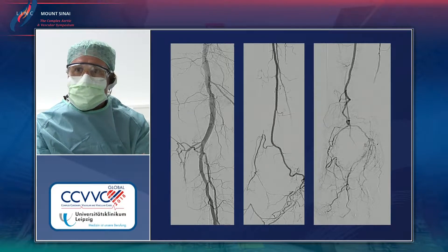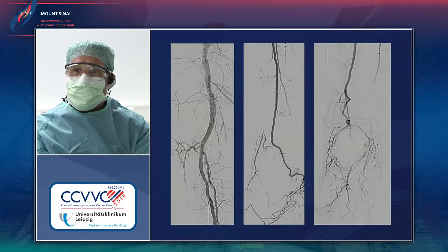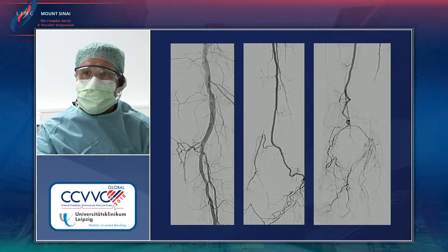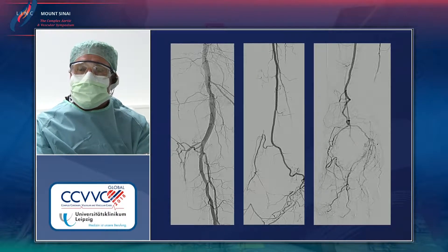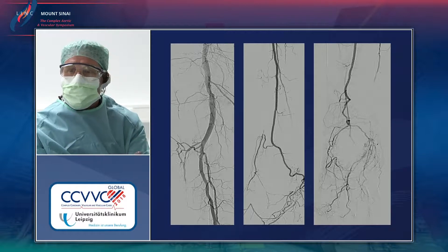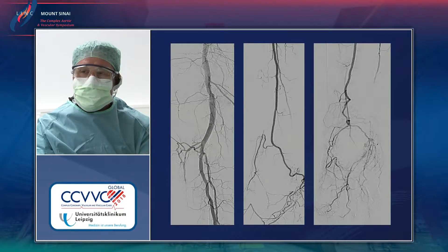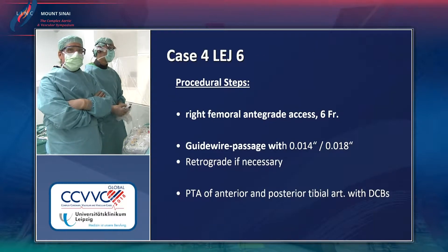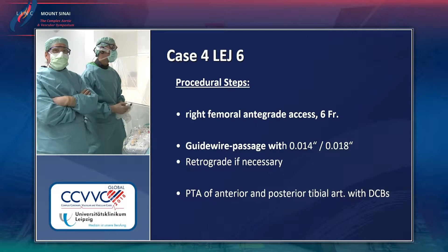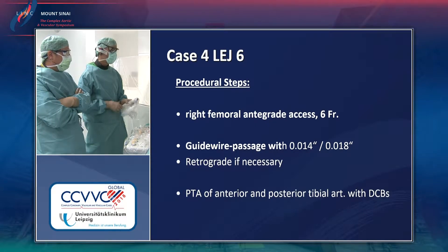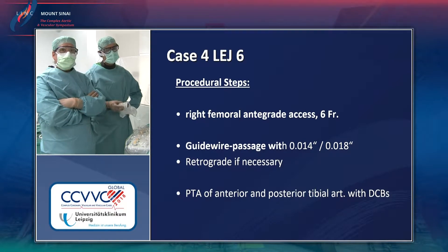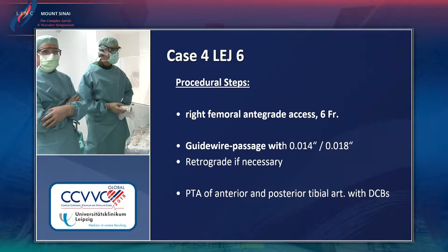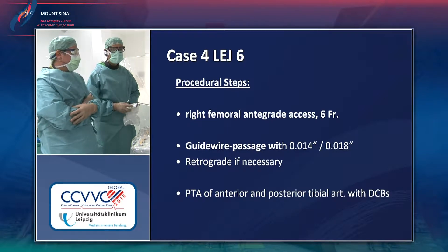This is the angiography of the below-the-knee arteries. Popliteal is okay, but there is a long occlusion of the anterior tibial artery as well as a distal occlusion and diffuse disease of the posterior tibial artery. The only artery going down to the foot is the peroneal, filling the foot arteries via very small collaterals, which explains the wounds of this patient. The strategy is to recanalize both the anterior tibial and posterior tibial artery if possible, then treat them with drug-coated balloons.